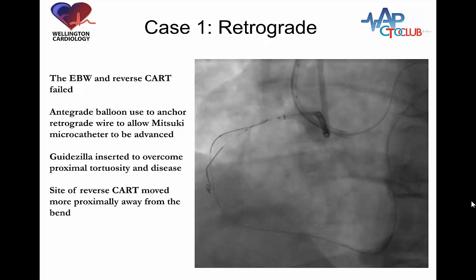The wire was changed out for a Pilot 200, which allowed the retrograde microcatheter to be advanced, and it was then changed to a GAIA Second wire. We now have a situation where the retrograde wire appears to have gone sub-intimal. It's important to note the large gap between the antegrade and retrograde wires on the bend. A Guidezilla has been advanced through the antegrade catheter to take the proximal disease and tortuosity out of play, a balloon has been advanced, and a reverse CART has been attempted.